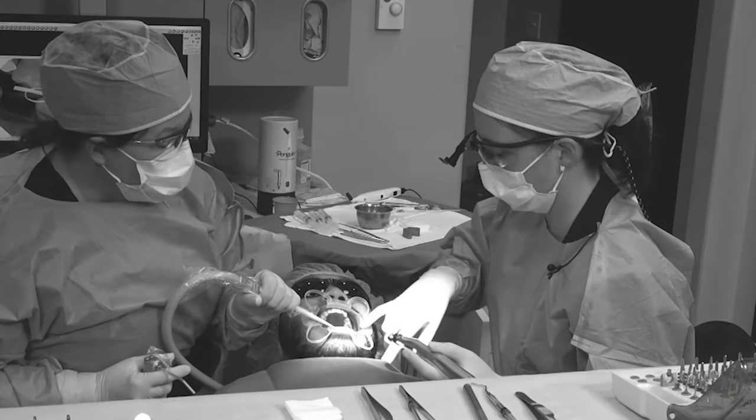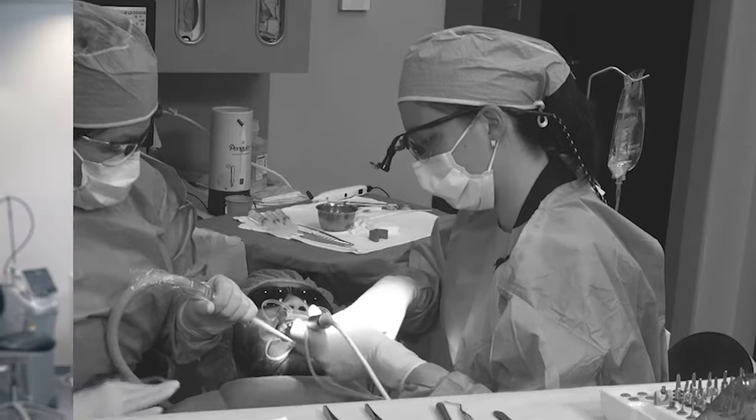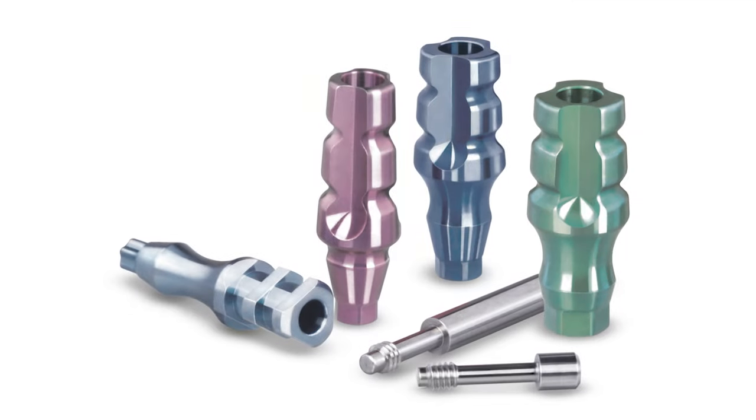Therefore, at the time of implant surgery, like many of us do, we placed a low profile stock healing abutment to help limit sheer forces on the healing implant. Let's take a moment to understand the emergence profile that has been created by this stock healing abutment.